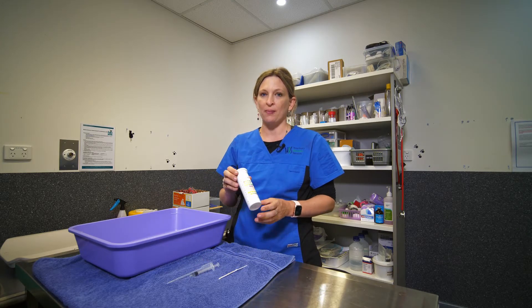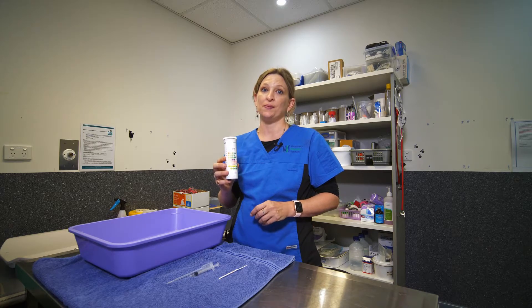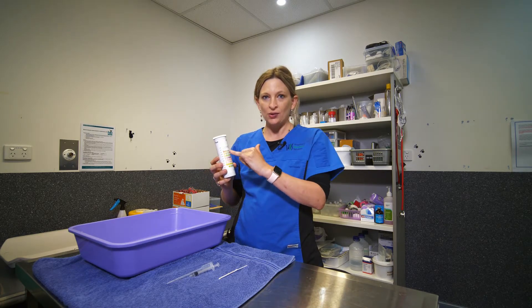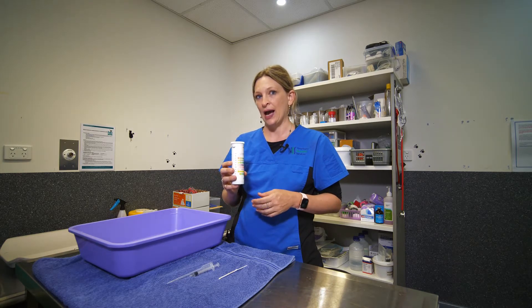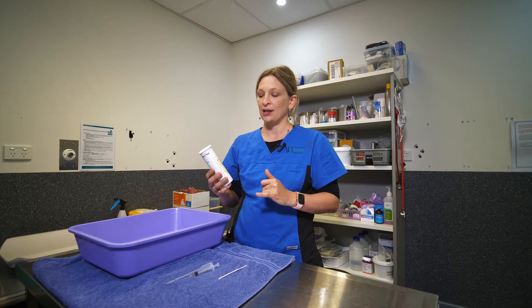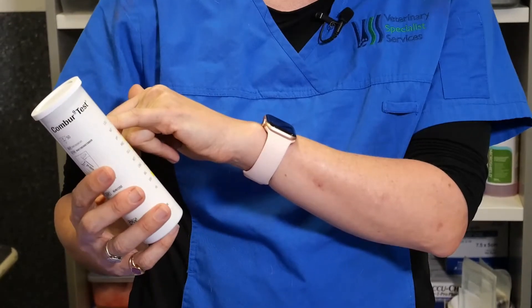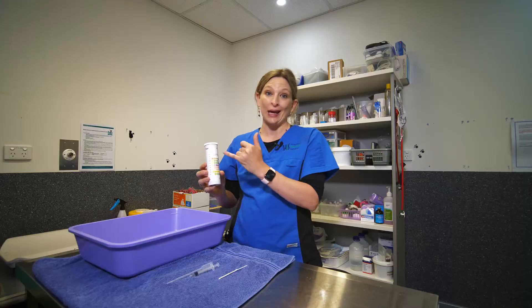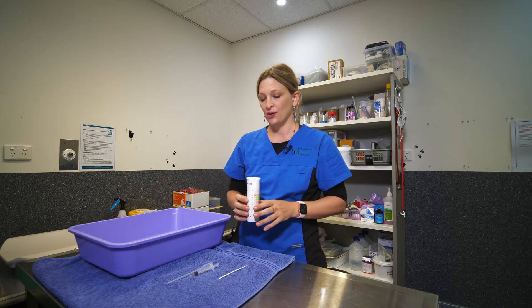The important thing to remember is that these are dipsticks that are designed for human use, so don't panic because there'll be lots of different tests on the sticks that actually aren't applicable to cats. Certain things like the leukocyte box will give you error readings in cats, so don't panic about any of the test results.